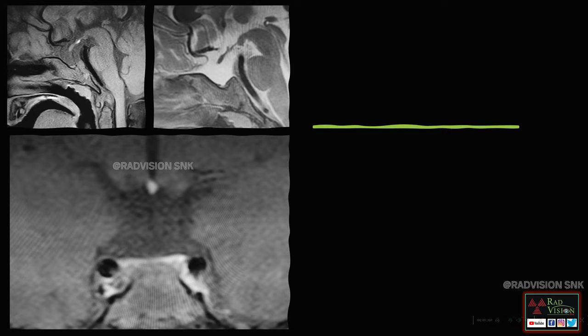Next, this is another case where you can see an ectopic posterior pituitary. There is complete absence of the infundibulum or infundibular stalk — here you can see the infundibular stalk is absent. Also, you can see the anterior pituitary is hypoplastic.